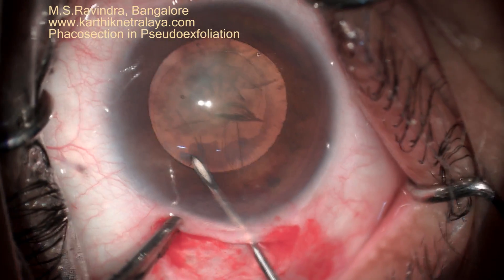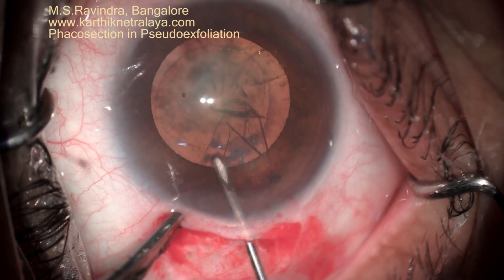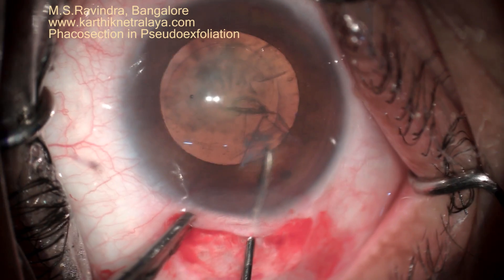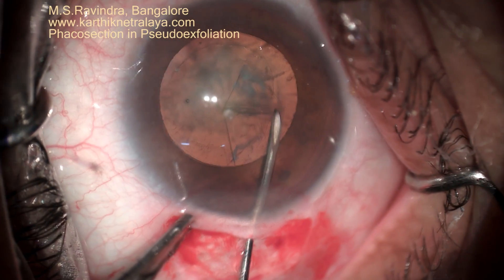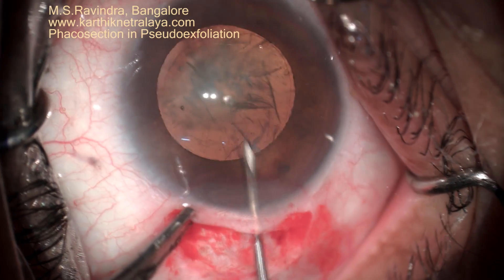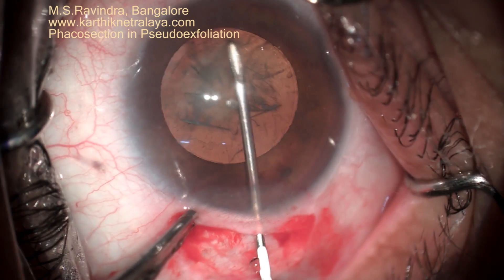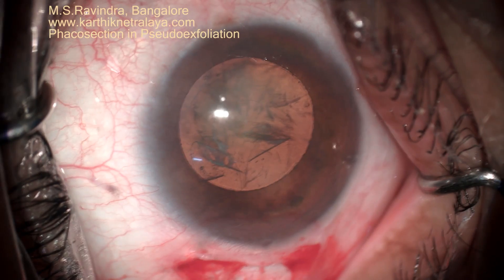With this technique, the tunnel remains closed. The entry is through a pinpoint at the limbus, through the floor of the tunnel, so there is no loss of viscoelastic and you will be able to do a comfortable, consistent, circular rexis — and you can enlarge it whenever you feel there is a need.